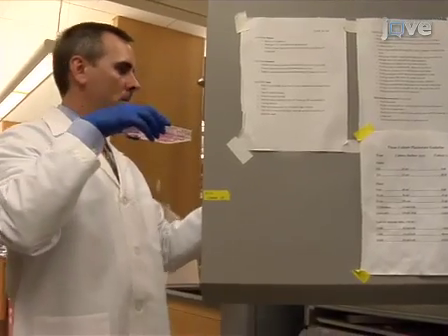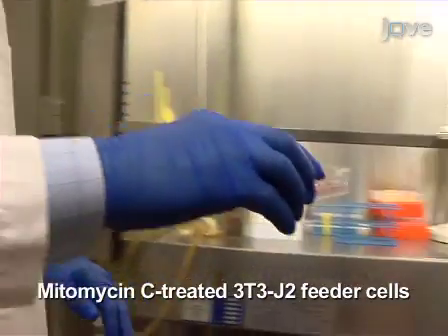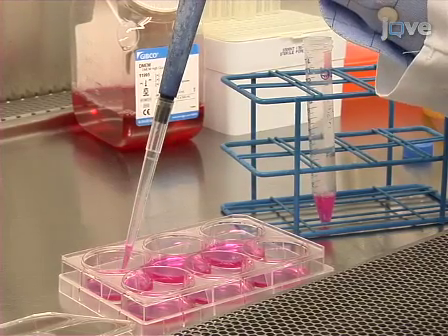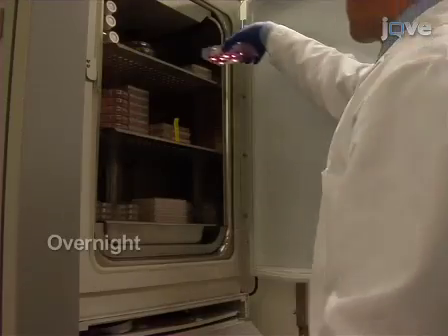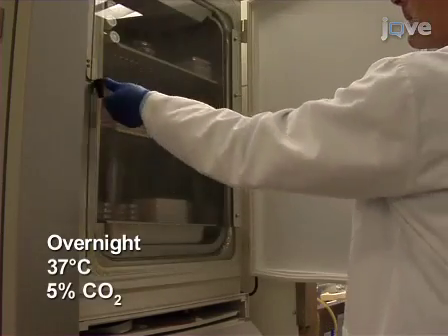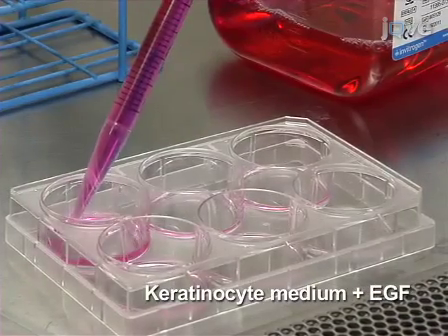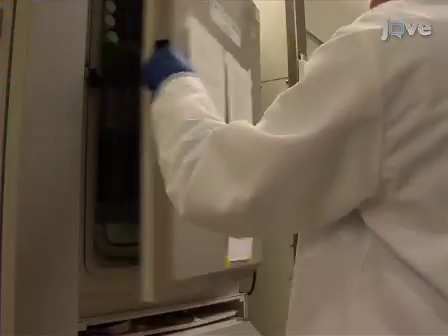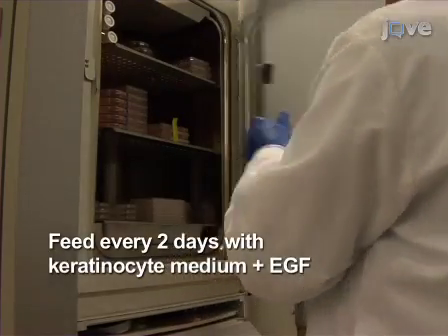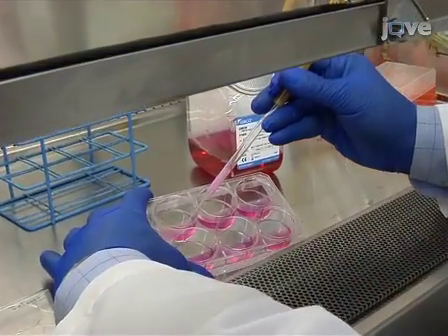Before plating the epithelial stem cells for culture, a six-well plate of mitomycin C-treated 3T3-J2 feeder cells should be prepared according to the written protocol. Then seed the isolated hair follicle stem cells and incubate the cells overnight in a humidified incubator at 37 degrees Celsius with 5% carbon dioxide. The following day, change the media to keratinocyte medium with epidermal growth factor and return to the incubator. Feed the cells every two days with keratinocyte medium plus EGF and grow them for 14 to 20 days.